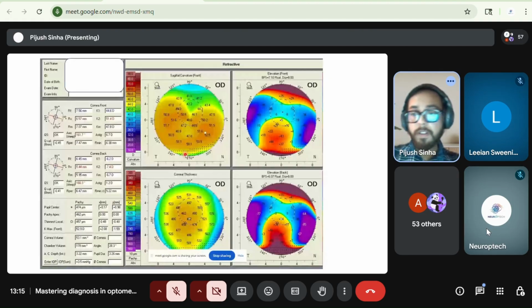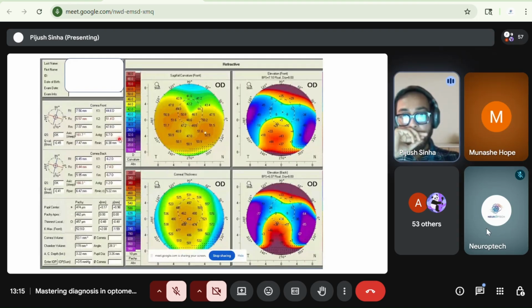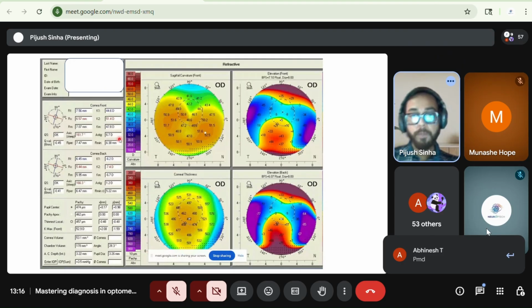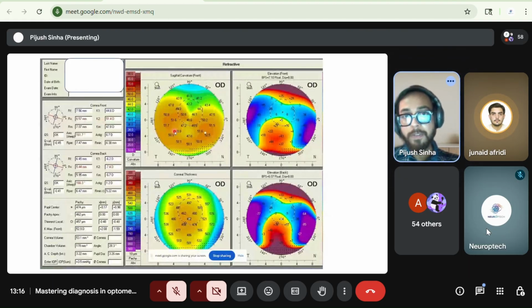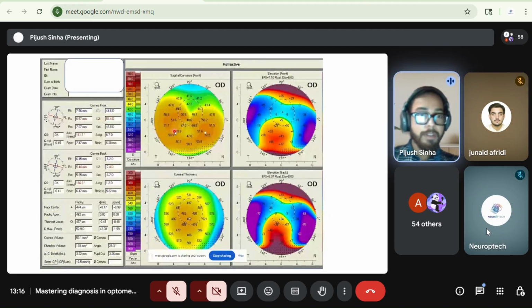Try. It's a corneal ectasia. Yeah, it is a type of corneal ectasia, but you need to name the specific case. PMD. Yeah, it's very nice. Can you tell your name, please? Junaid. Yeah. So you are right, Vinodji. It is a case of PMD.